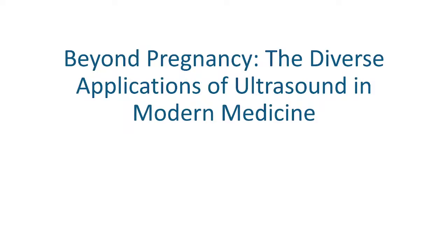This looks like a very simple, straightforward topic, but it's not. Because this is now the foundation of what we are supposed to do. It's the syllabus of medical ultrasound. So what we are going to discuss now, I need you to pay very particular attention to our syllabus of ultrasound. Beyond pregnancy, the diverse application of ultrasound in modern medicine. This is my presentation today.